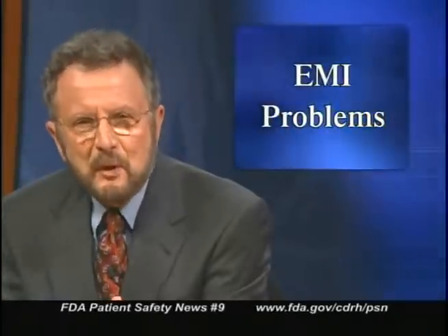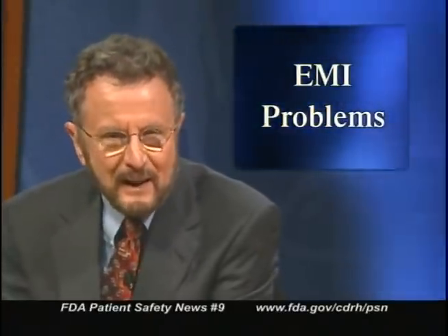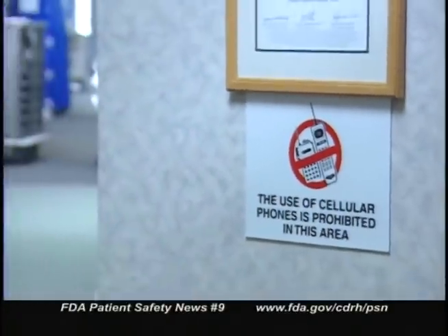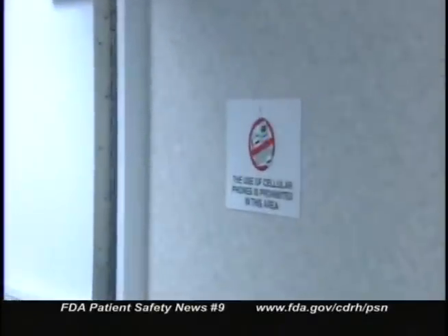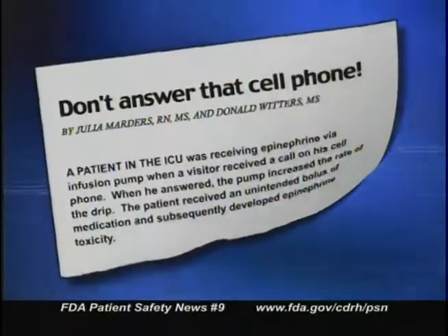These days, most health professionals have heard about the problem of electromagnetic interference, or EMI — the hazard created when electronic devices like cell phones interfere with certain electrically powered medical devices like infusion pumps. Most hospitals already have signs warning patients and staff about using electronic devices in certain areas. Yet interference continues to occur, and although it's rare, patients can be injured. One interference incident is described in an FDA article entitled 'Don't Answer That Cell Phone.'